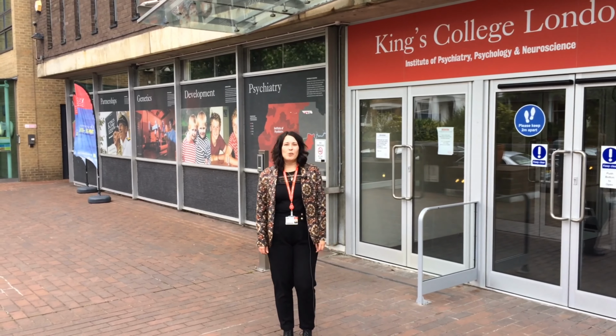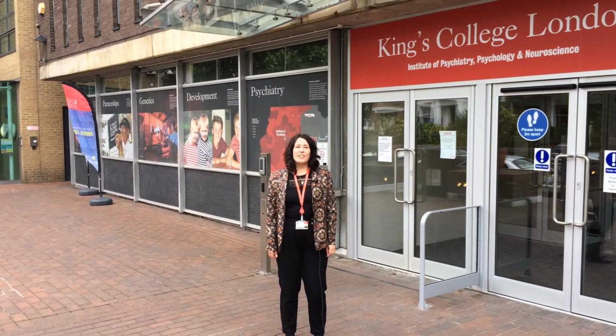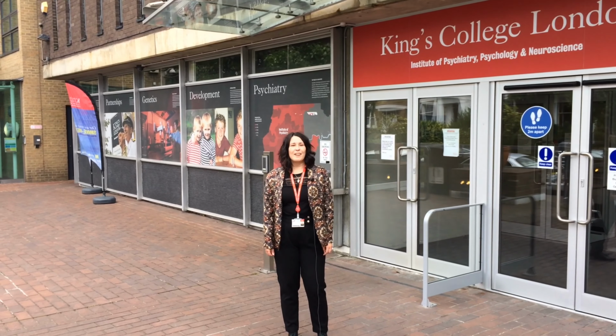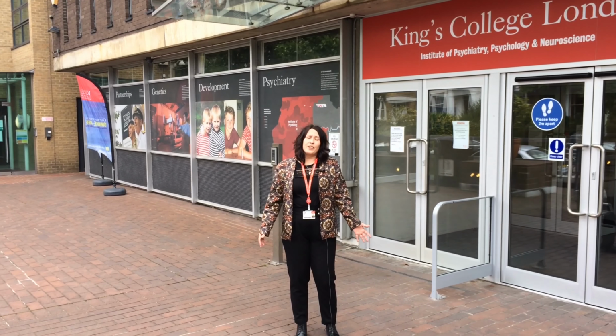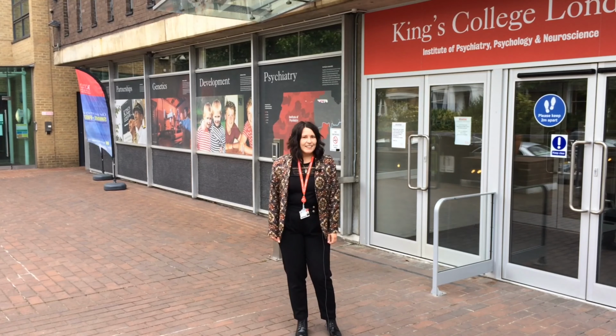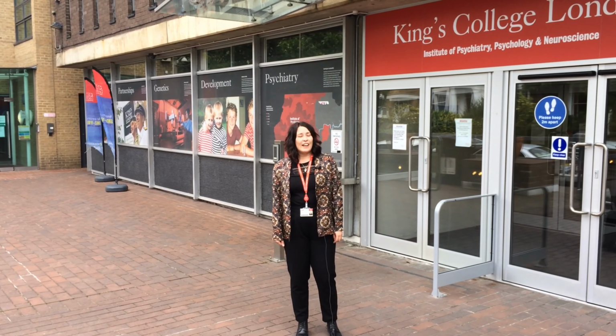Hello, I'm Katja Brotmann. I'm a teaching fellow in the new and exciting Bachelor Neuroscience and Psychology program. And I will be responsible for some modules, for instance, for psychology. But today, me and my colleague Andrew will show you how we do an EEG experiment.